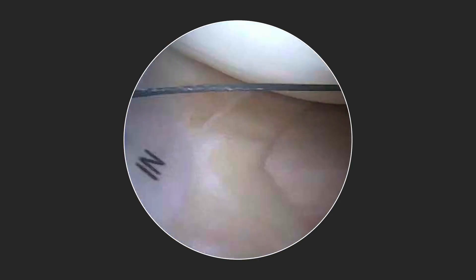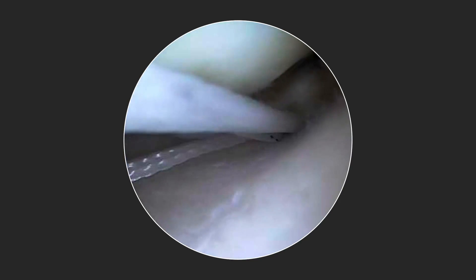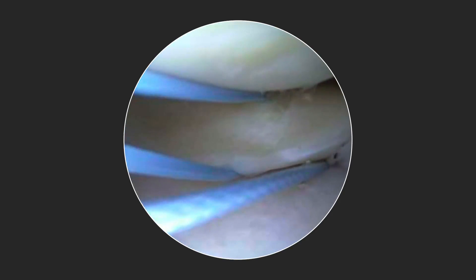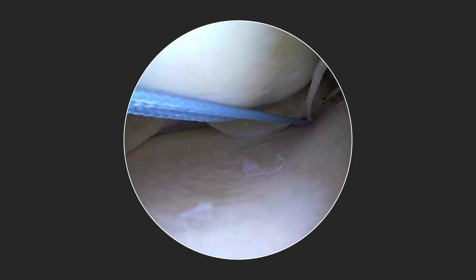With passing the SutureLock into the tunnel, we can see the most proximal aspect of the implant, and once that proximal aspect is adjacent to our tunnel we can slowly dunk that implant just below the surface of the proximal tibia, allowing for fixation at the joint line. Tugging upon the implant reveals excellent joint line fixation. Once the repair suture is confirmed in the appropriate position, we use our passing suture to shuttle the repair suture down our implant. You can see that as we shuttle this repair suture, the meniscus goes from having laxity to a more taut and anatomic position.